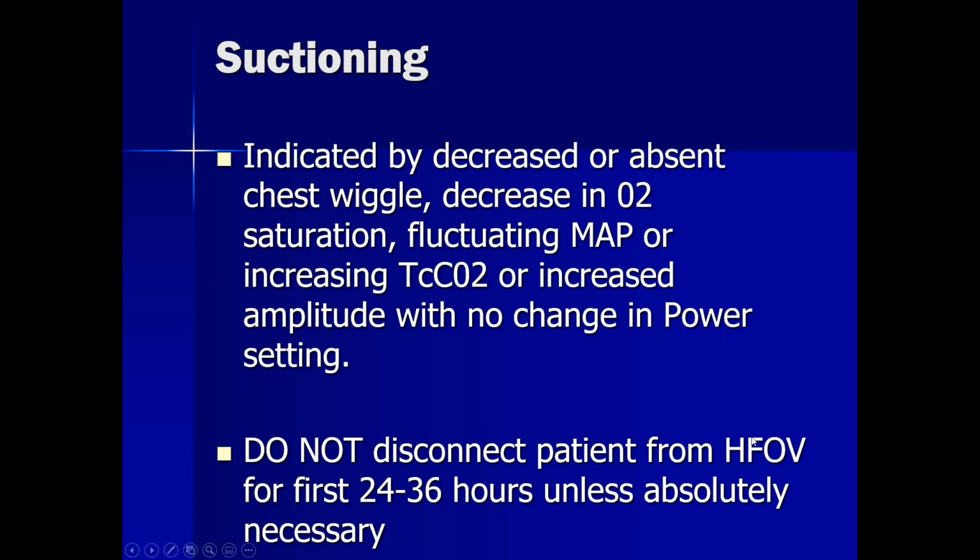Do not disconnect the patient from high frequency oscillatory ventilation for the first 24 to 36 hours. Do you know why? Because you've recruited the alveoli and you're keeping them open. And as soon as you disconnect, the alveoli collapse and you've got to start all over again. So you don't disconnect because you don't want the alveoli to collapse.